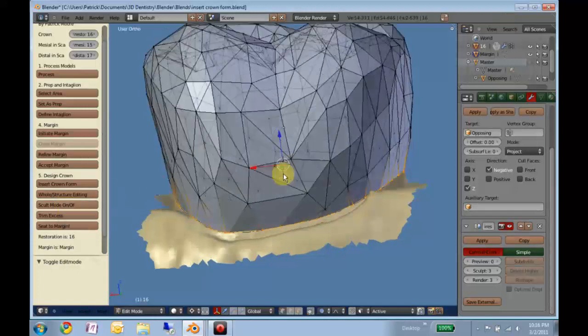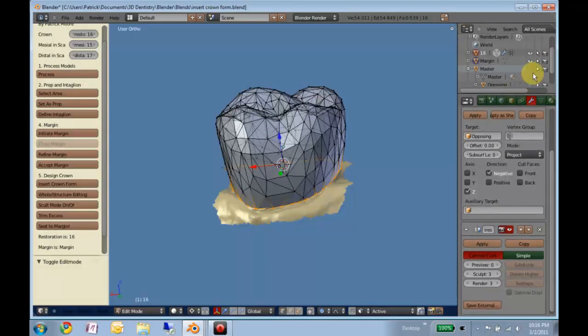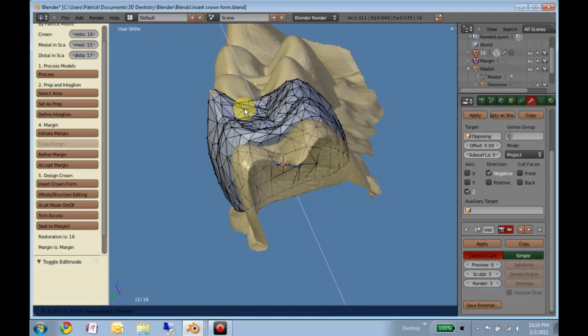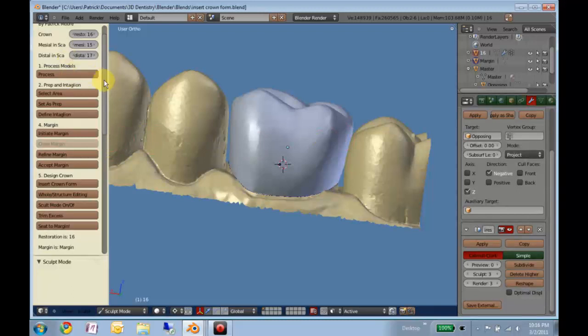Alright, so now we're in a position to really refine this crown. And I don't think there's a need for me to show all that happening. But you can grab individual cusps and move them. If you use your proportional editing with the scroll wheel, you can move bigger pieces. In sculpt mode, we can use various brushes.